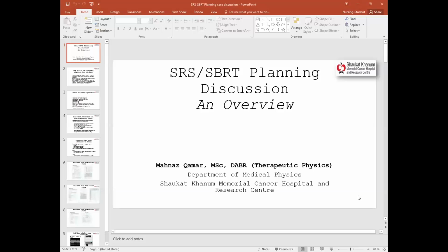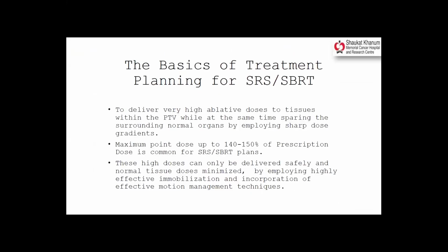Just to go over a few points. As Dr. Yo mentioned, the basics of treatment planning of an SRS SBRT treatment is to deliver very high ablative doses to the tissue within the PTV, while at the same time sparing the surrounding normal organs.